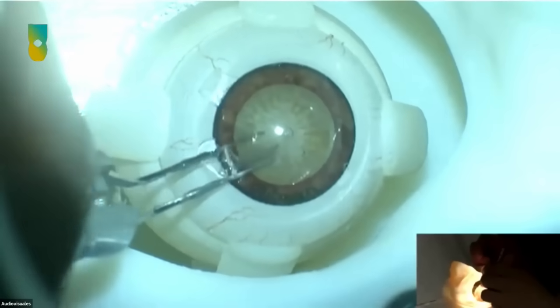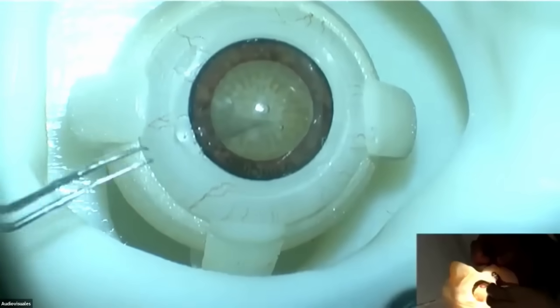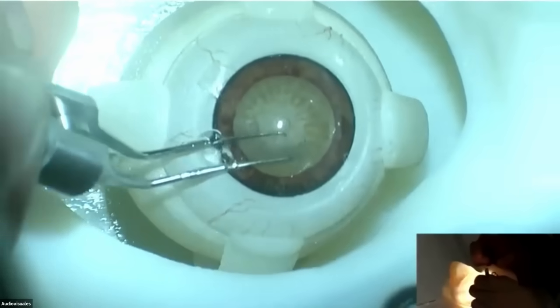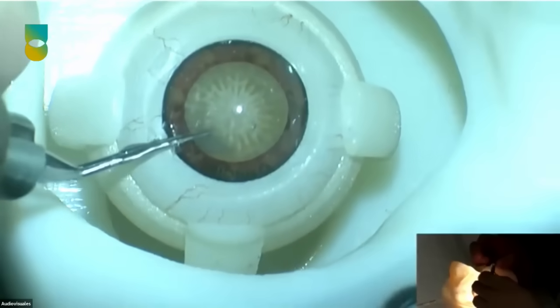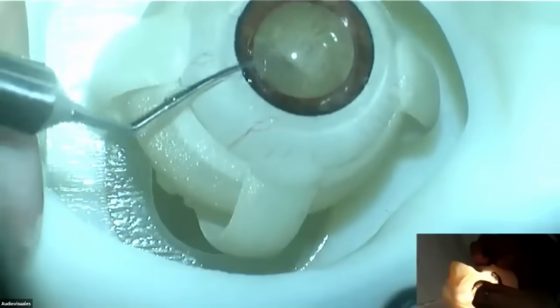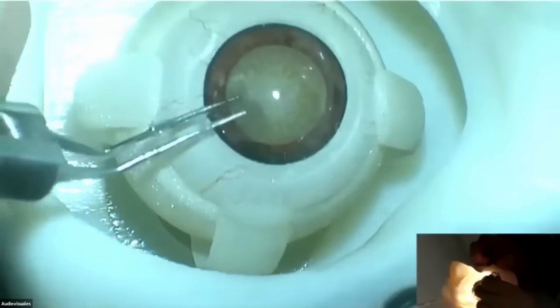Here we have some input from Pablo Robles in our chat. Pablo is saying he uses a second instrument in the paracentesis. That's a very good idea. When you have a dry cotton swab and you fixate the eye, that's useful in most of the cases. But when patients start to move, you can use your forceps, but you can also use what he says.